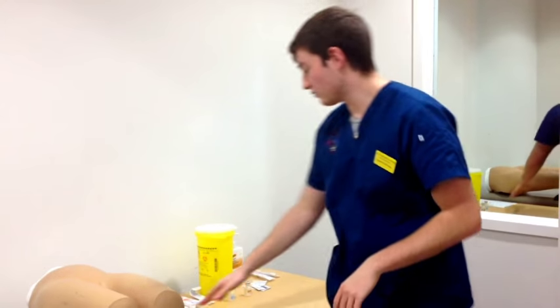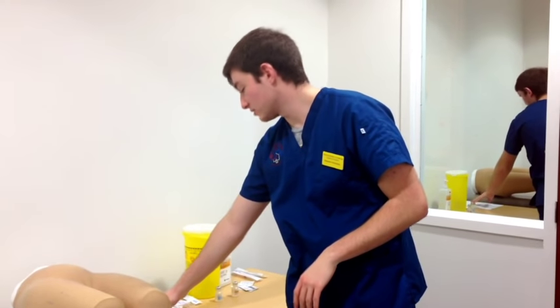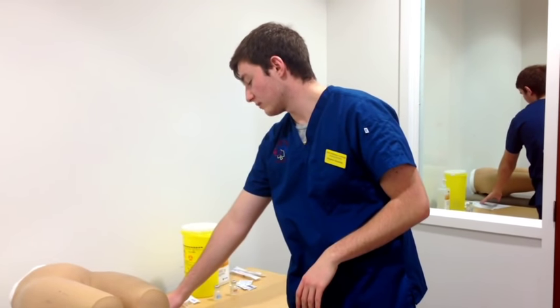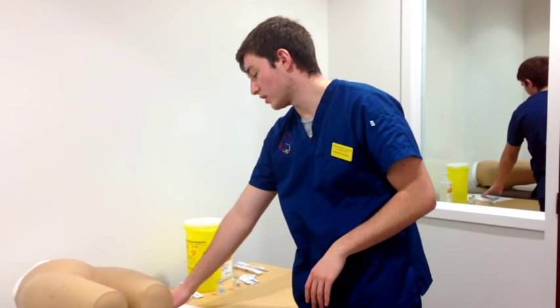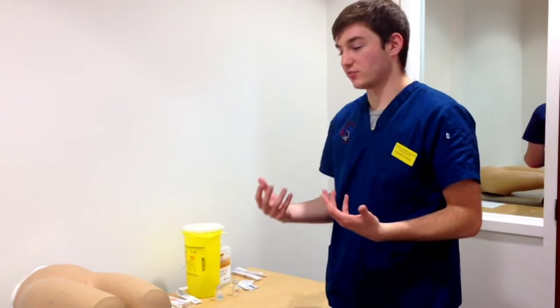With the patient here, we have Mr. Mancini. The orders are for 5,000 units of heparin subcutaneously every 12 hours, and for Haldol, 1 milligram intramuscularly every 4 hours as needed. The next step is making sure we have the right medication present.